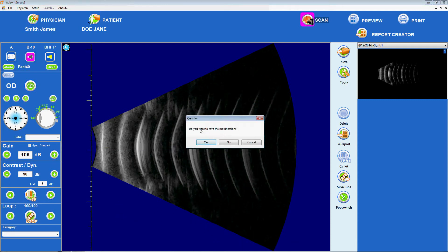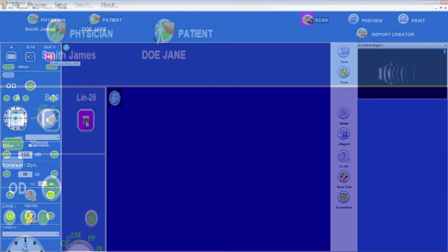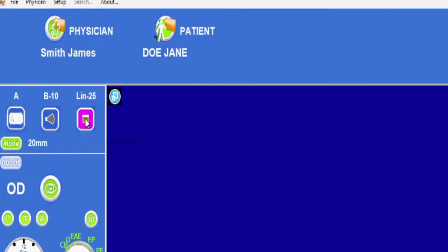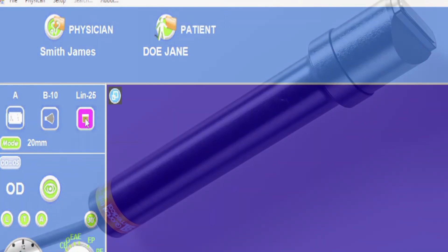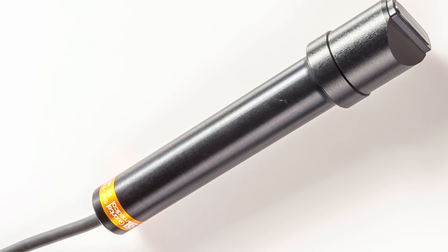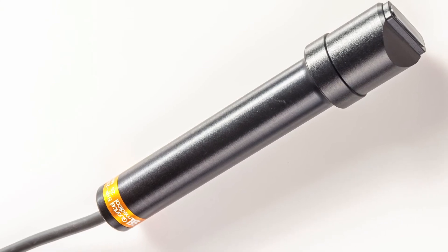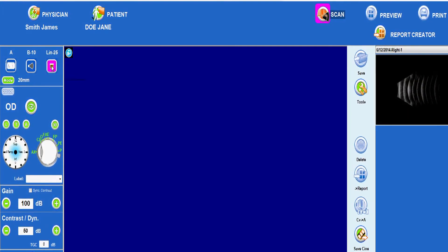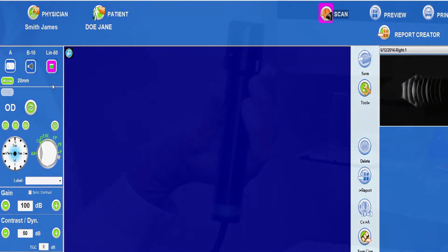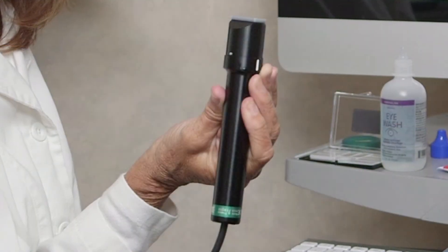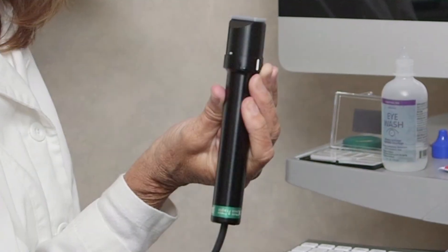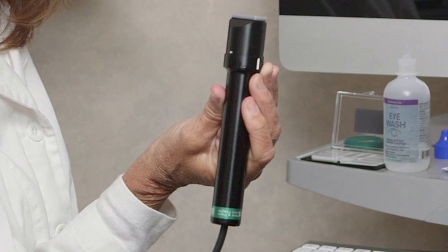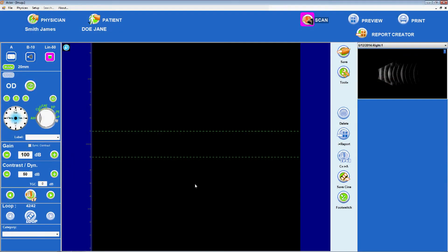To use a LIN 25 MHz probe, select the HFP icon and toggle until it says LIN 25. The 25 MHz probe is ready to use as delivered from the manufacturer. By toggling the same icon, the LIN 50 MHz UBM probe can be selected. It is critical to ensure that this probe has been properly prepared and filled with distilled water prior to use. The depth mode for both of the linear probes is 20 mm.